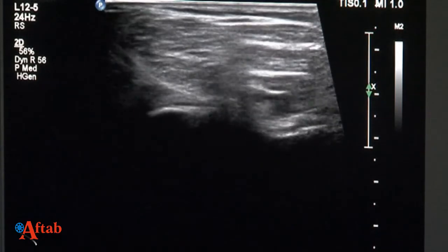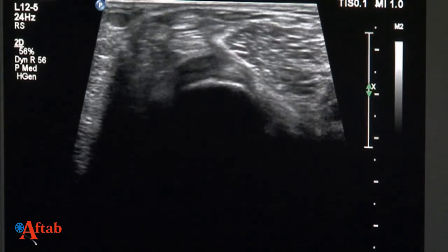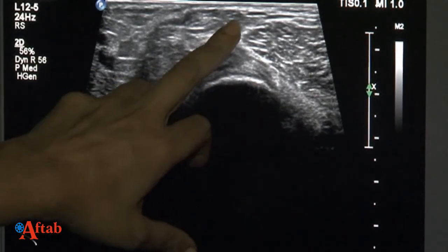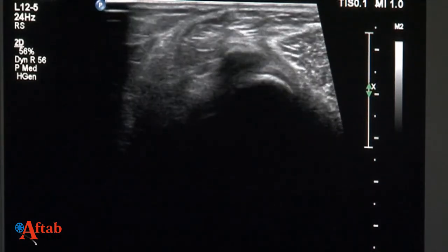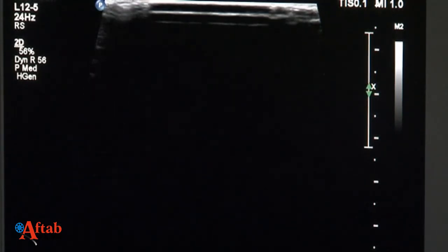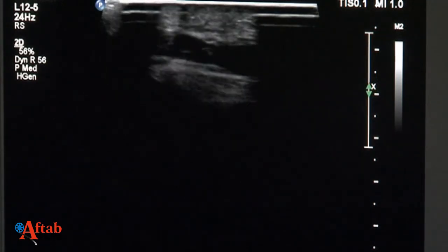And if I go medially and try and see in my short axis, is the medial head of the gastrocnemius tendon right here. So in between the two, you can see the continuity, how the Baker's cyst would come and sit there, just in case there is one. So there is hardly any reason for us to think that there is a posterior pathology. So by and large, what he has is a prepatellar bursitis with synovitis, which is giving inflammation to his entire knee joint. And thank you very much.